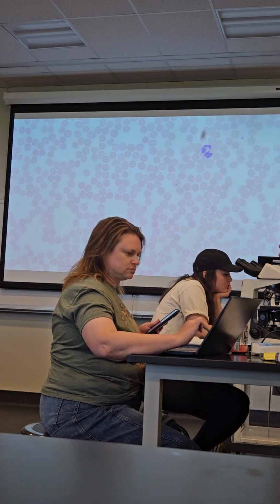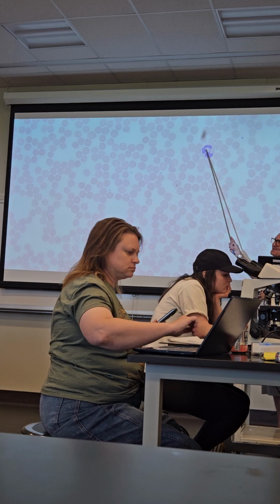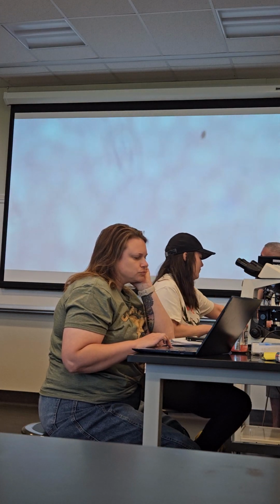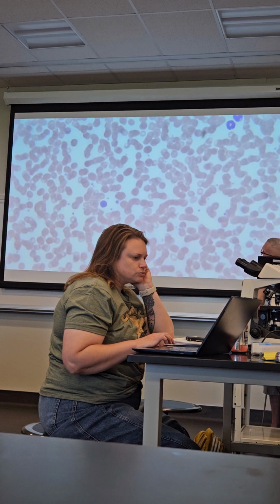What's that? It's a neutrophil. Remember, the nucleus is the strand of pearls. That one had 5 lobes. They must be low on B12. So we've got to give those persons B12. They've got matching neurologic symptoms.